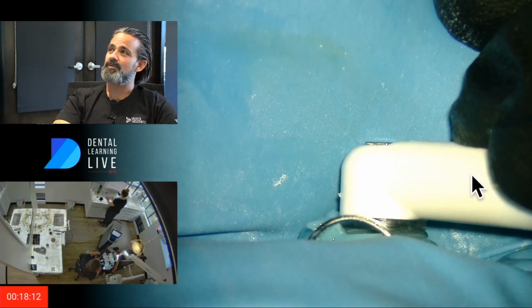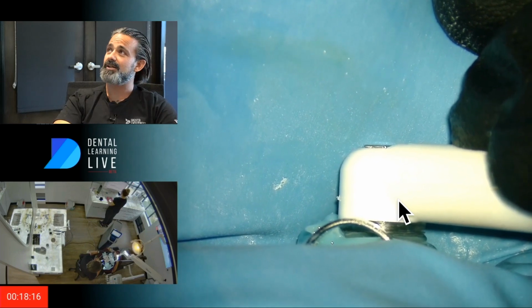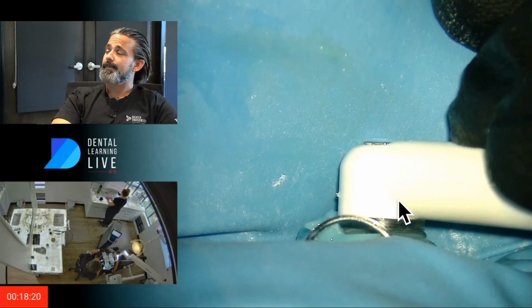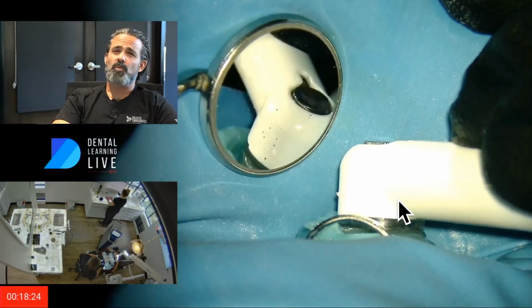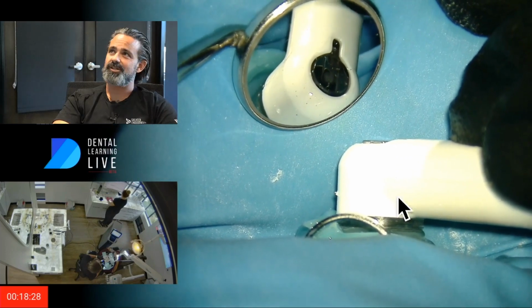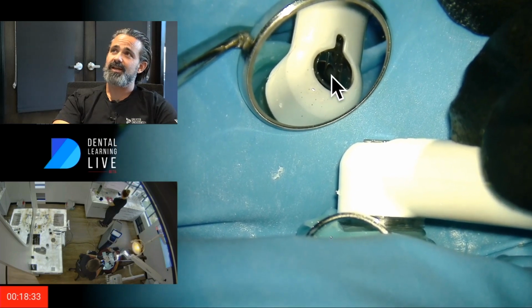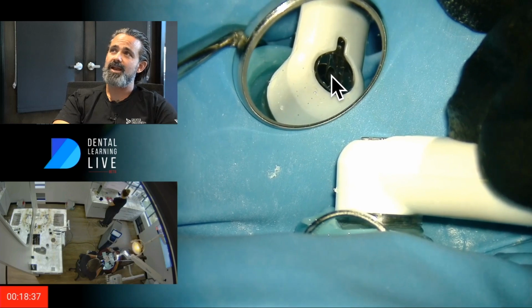All right, so if you look in the red box, that got left off one of my last videos, drove me nuts actually. So we're 18 minutes into the case. You know, when I'm watching, if there's any leaks around the silicone, you just suction it up. We got a little bit of splatter. But I'm really actually watching that dancing bubble. That's the energy employed. So that's the fluid dynamics employed.